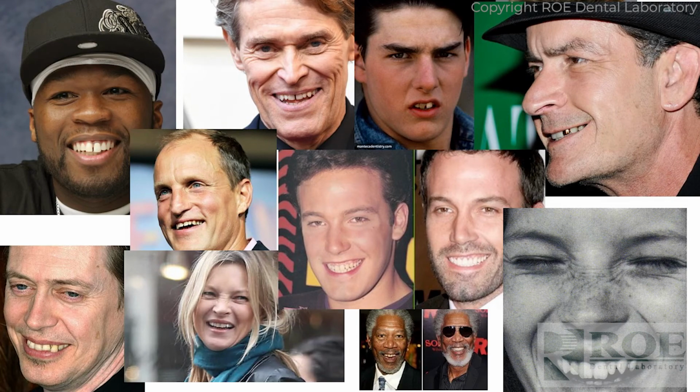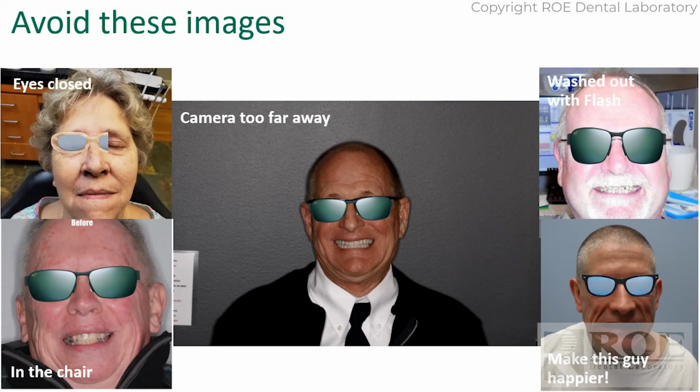That's often an issue because the world is used to doing selfies, and they do it from all different positions. These are obviously not very good selfies, but normally pictures that you would see, they're not straight on at all. They're from all different angles, and it makes it really tough to do a smile simulation and really tough to do case analysis when we have photos from all over. These are some examples of pictures that really don't work.